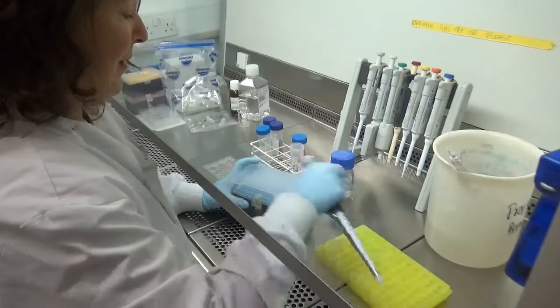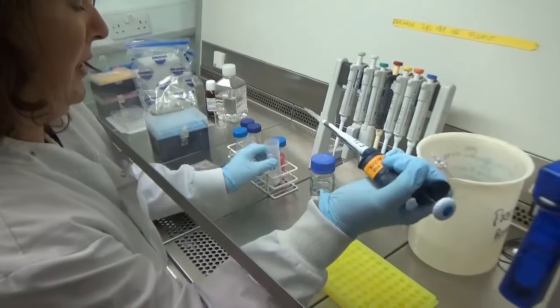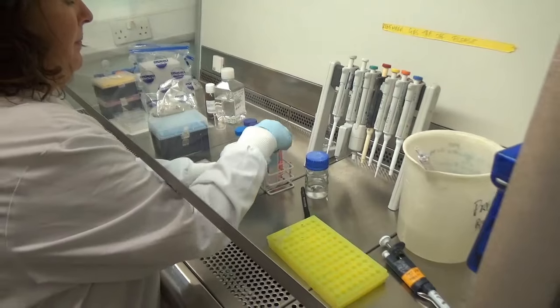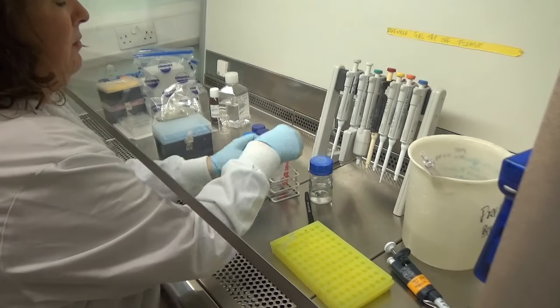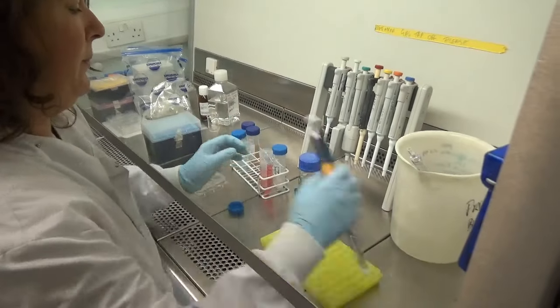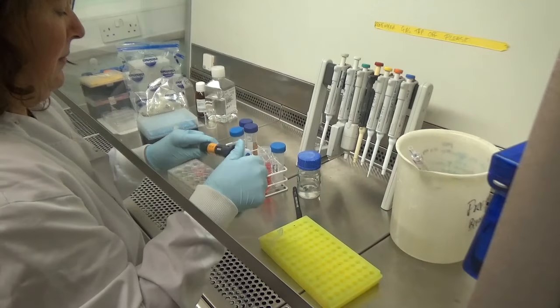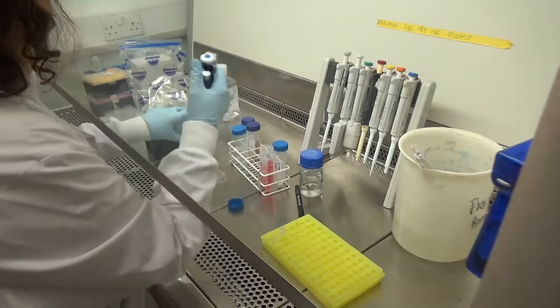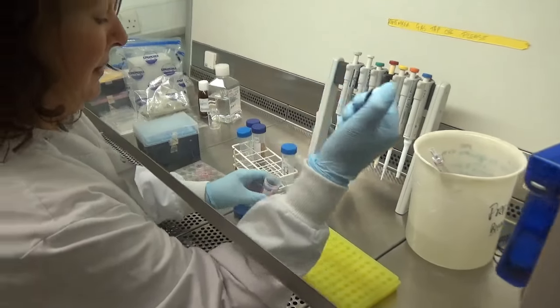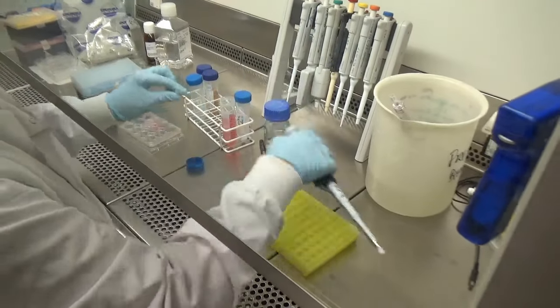Right, so this is how I'm making the contraction gels. So we use something called collagen, which is present in your skin in abundance. Mix that with some medium, and then we have to make it to the correct pH so that it doesn't kill the cells. So just add this, which is just medium that makes the cells happy. It gives the cells these nutrients that are required for them to grow happily.